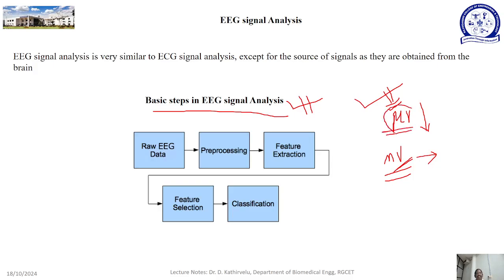The reason for this is that the brain cells' electrical activity is measured at the scalp, as the electrical potentials are captured on the superficial layer, and there is a possibility of a large amount of attenuation, which makes the amplitude very low.